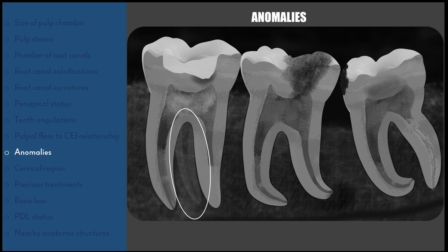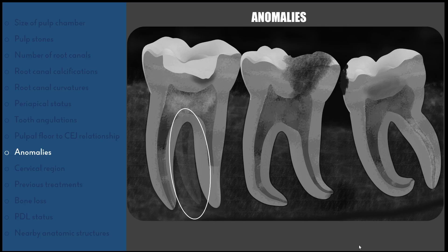Root canal anomalies are much more common than what we think. In this radiograph, between the mesial and distal root of the first molar, you can see a faint root — that is the extra root called the radix. If the extra root appears in the distolingual region, it is called radix endomolaris. If it appears in the mesiobuccal region, it is called radix paramolaris. In this example, it is a radix endomolaris. These extra roots are often missed and are one of the most important reasons for failure of root canal treatment. Two or more angulated radiographs should always be taken preoperatively and evaluated properly before initiating root canal treatment.